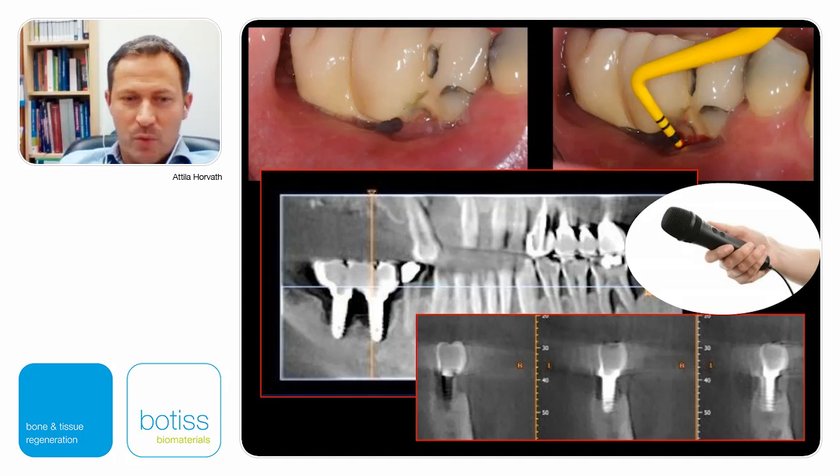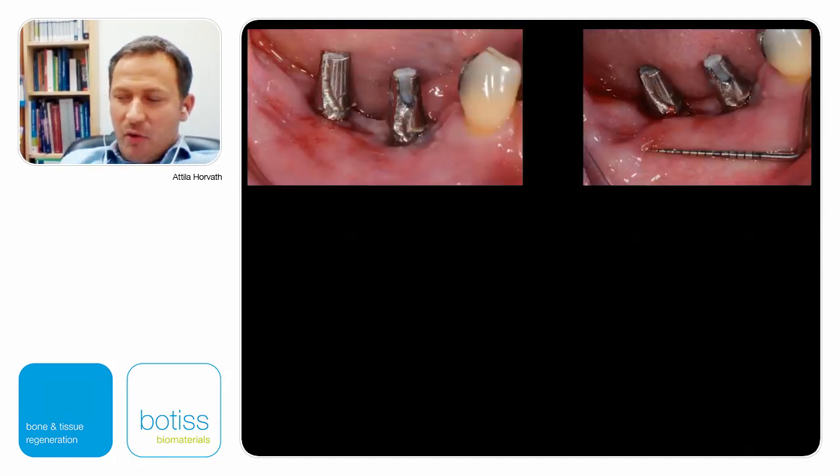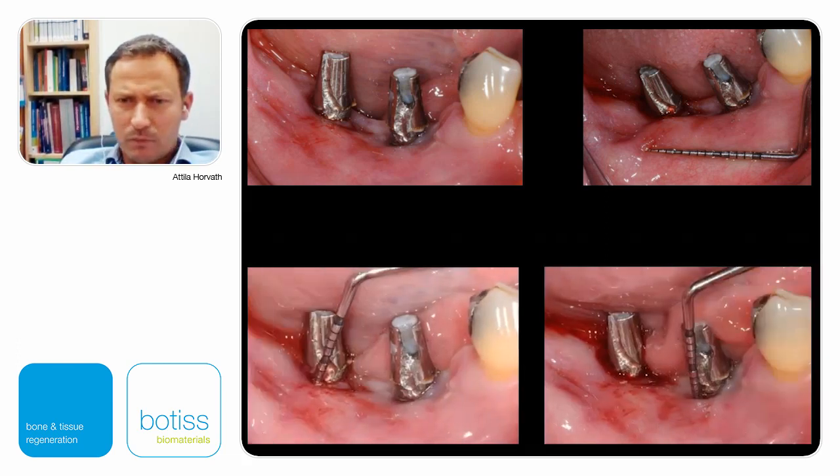So what other option do we have? And actually, I thought that, okay, let's take this structure off, let's do some non-surgical cleaning. And also, I've seen that there is not much keratinized gingiva, so let's reconstruct this tissue. And I was hoping that the patient in that time will be ready for the explantation, and we can get the job done.